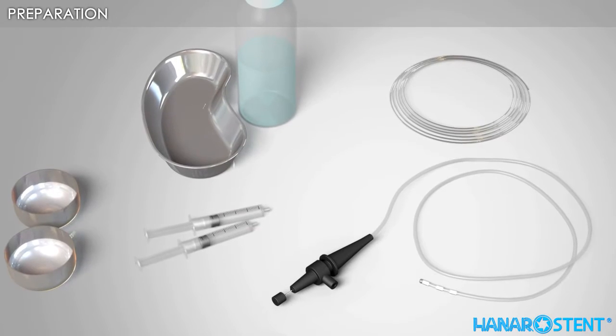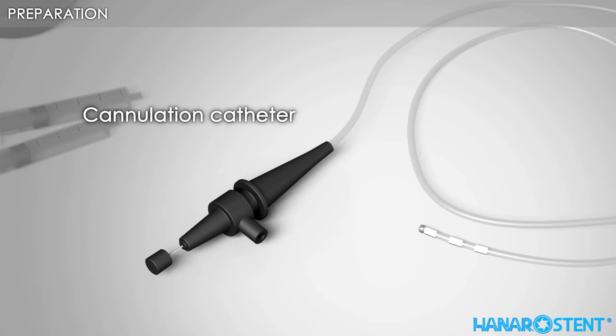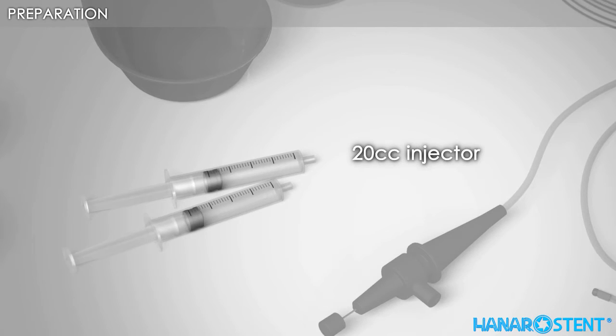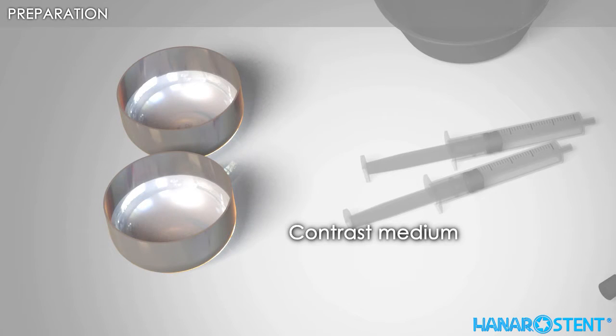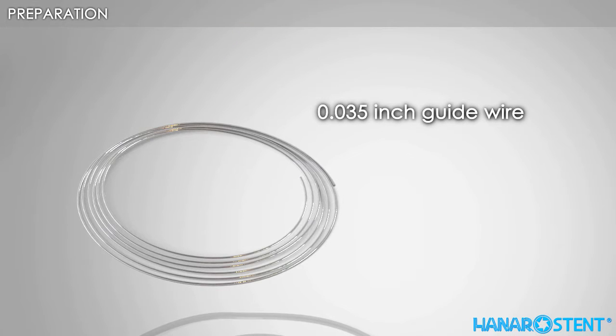Here are necessary tools for a stent procedure. Cannulation catheter. 20 cc injector. Contrast medium. Saline solution. 0.035-inch guide wire.